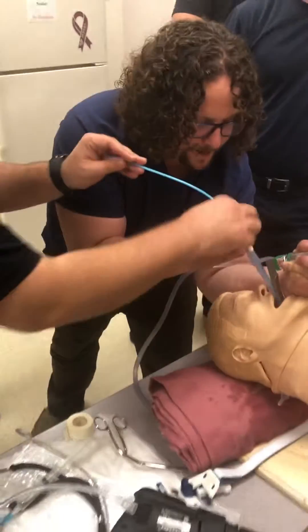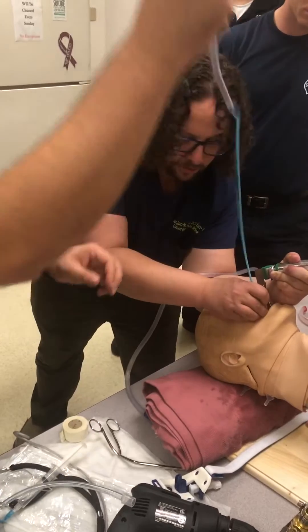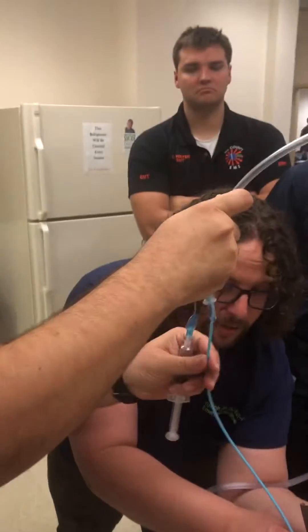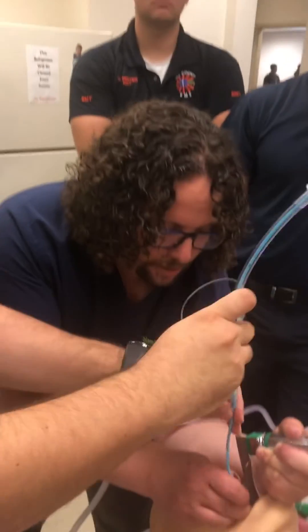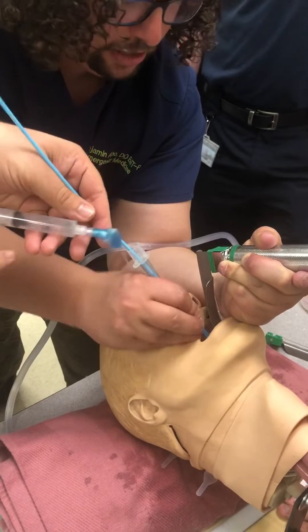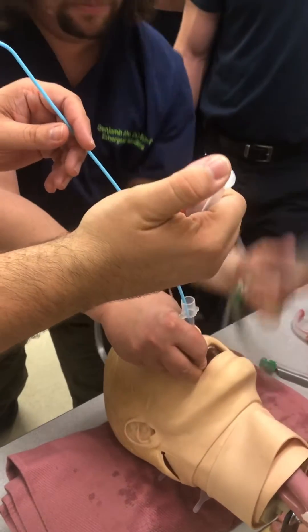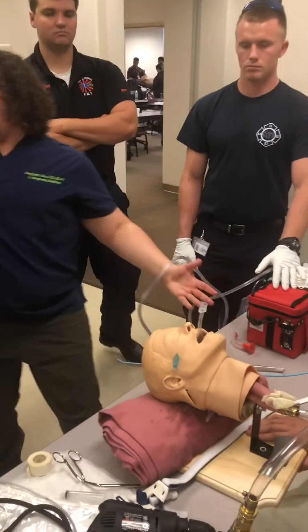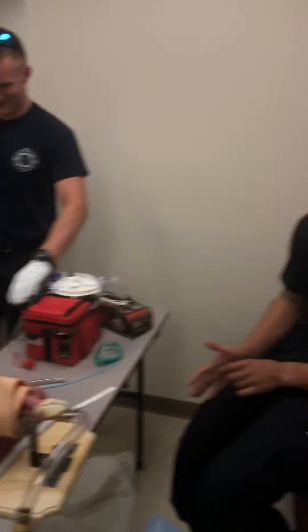Go ahead and pull this out. I got the bougie — go ahead, pull. Tube — tube with no stylet. I'm going to push this through. 22 at the teeth. So that's important — we know our tubes, we know how deep we usually go in an adult: 8-0 tube, 22 at the teeth. Everybody's impressed — how about a round of applause?